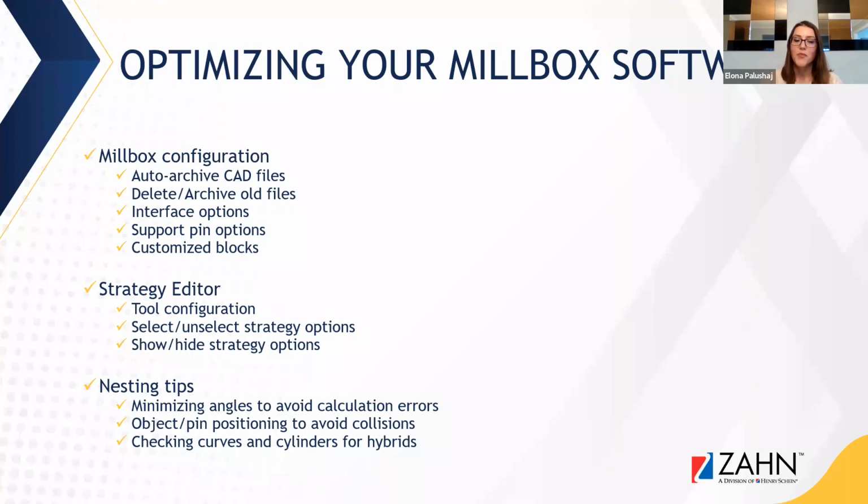So this will be beneficial to both, absolutely. So whether you're thinking about what cam to get next or how to optimize what cam you're using now, which are those that are using MillBox, there will be a lot of information that will be covered here. Some may be a little bit more advanced, so if you have questions, please feel free to ask, and we'll cover them all at the end. But I'm looking forward to bringing in all of those that don't already have MillBox. I promise you'll like it.